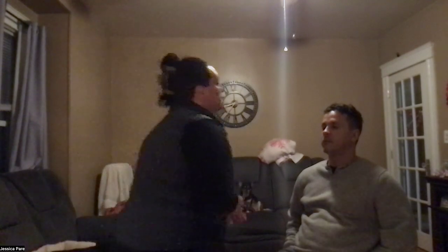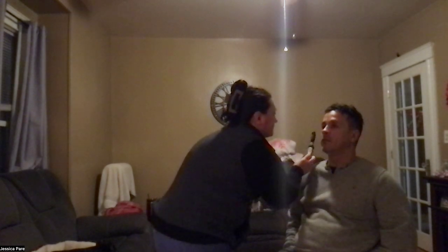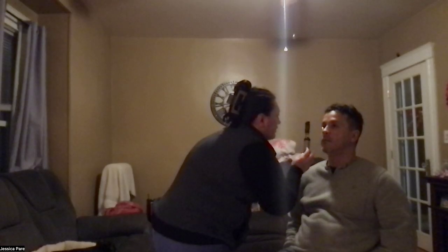Next we are going to move on to his pupillary accommodation to light. Now again, I don't have my pen light, so I am going to use the ophthalmoscope light to check his pupillary response to light. Just look straight ahead for me. Perfect. So his pupils constrict with light. They are equal and reactive. So he has good accommodation.